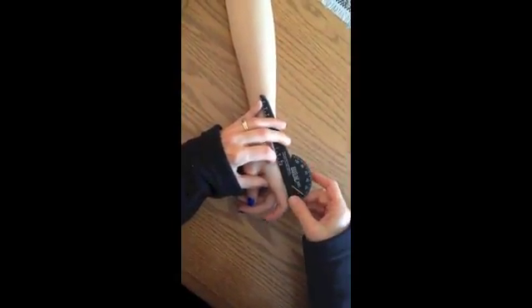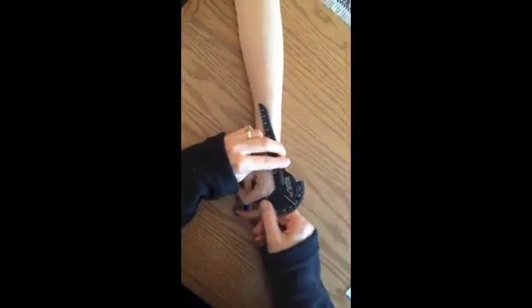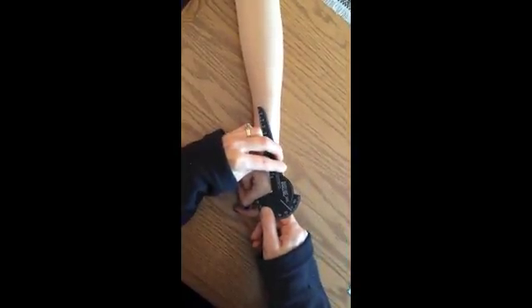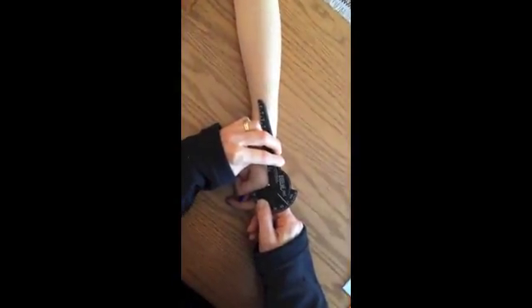So bend your finger. And she is 0 to 78 degrees.